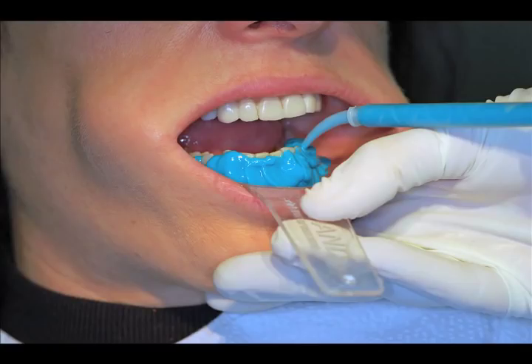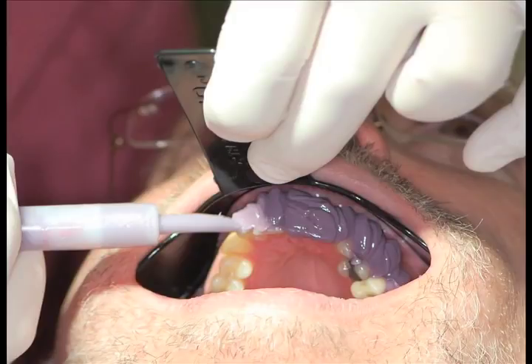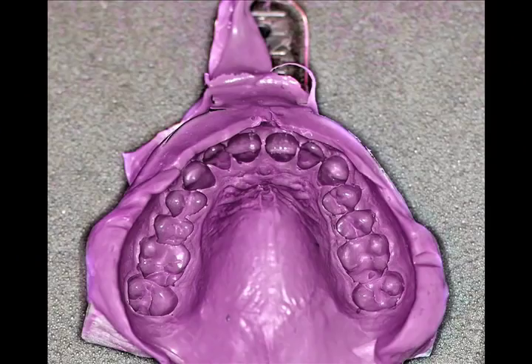Another challenge is holding the lip out of the way while syringing light or regular body impression material bilaterally against the teeth. Once the fifth hand is in place, the impression material can be placed along or around the teeth and then the lower tray seated over the dental arch. In utilizing the fifth hand, the lip cannot fall back against the teeth. Here I am taking a final polyether impression for a no-prep veneer case.